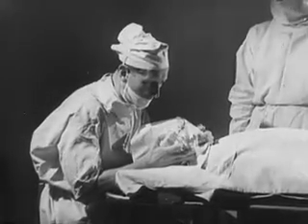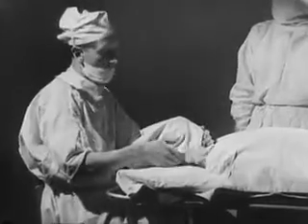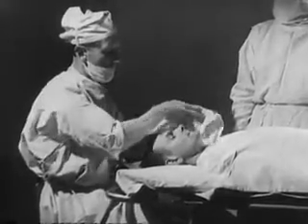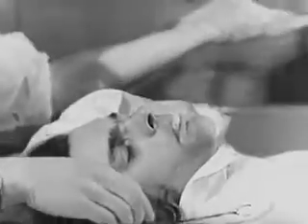This patient's airway doesn't seem satisfactory, and the anaesthetist can hear bubbling sounds. He lifts the mask and finds him pouring saliva. The premedication was given only 5 minutes before the anesthetic and has not had time to act. Probably the commonest mistake you'll come across.